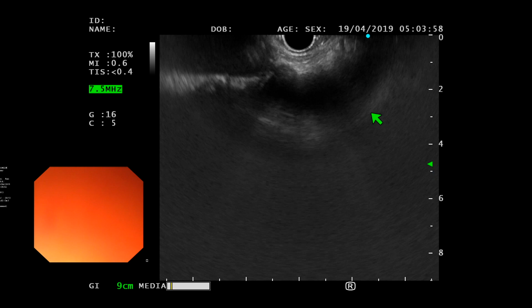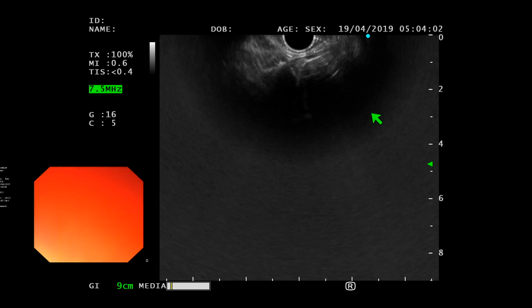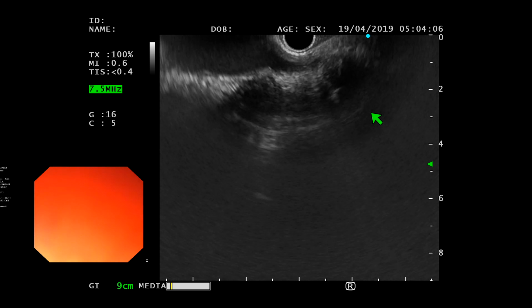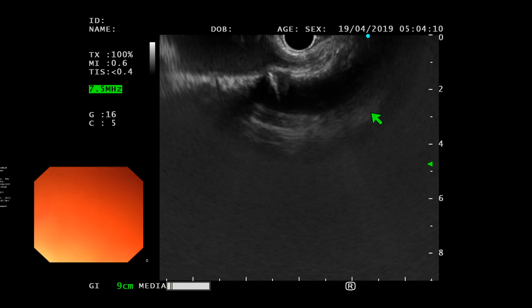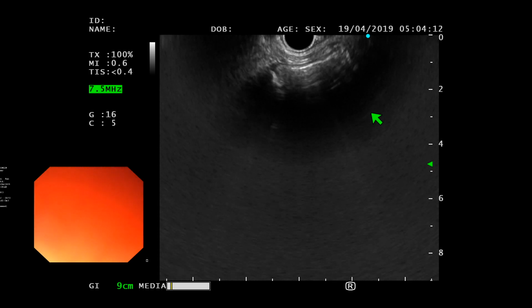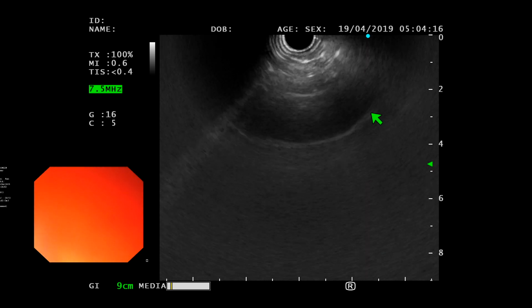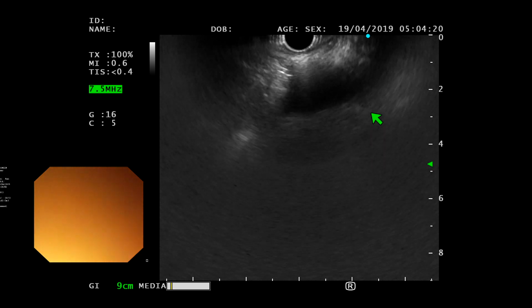Okay, keeping aorta in the focus there. That's okay. That happens. Yeah. So keep going. Keep pushing. Oh, that's okay. This happens. Give, just easy giving. Doesn't matter. Don't worry.